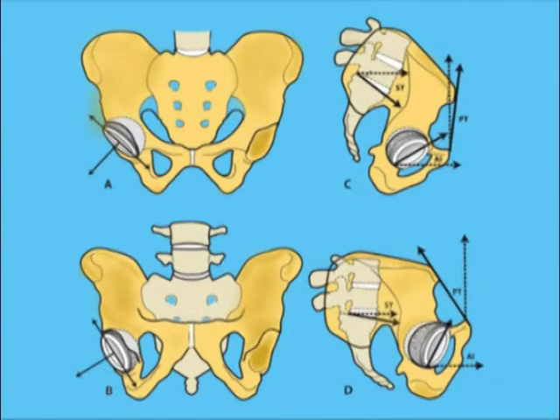For instance, if we look at the implants, the standing position is the AP of the pelvis that you're looking at, and the sitting position is more of the lateral tilt. And if you look at the top row, you see the cup in a standing position, the AP pelvis and the lateral. And then you look at the bottom row and you see what happens when the patient sits. You see the increased inclination that you have. You actually have increased anteversion also.